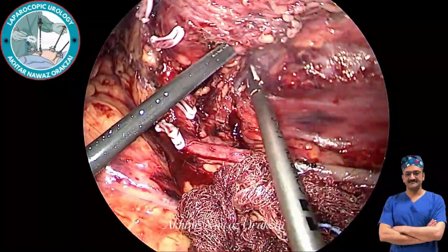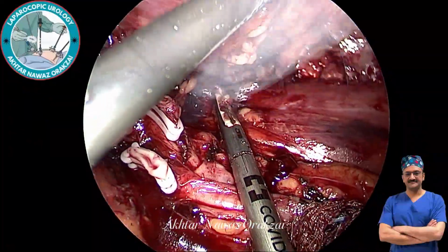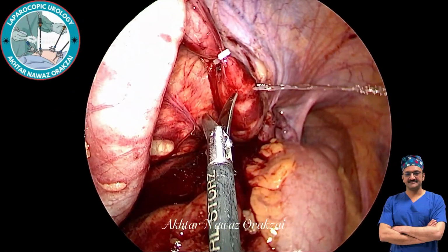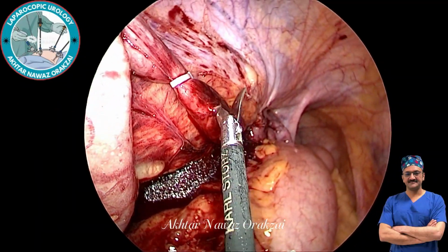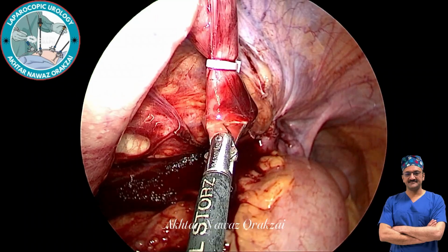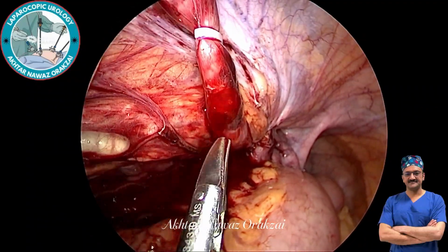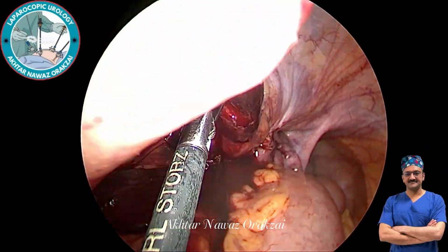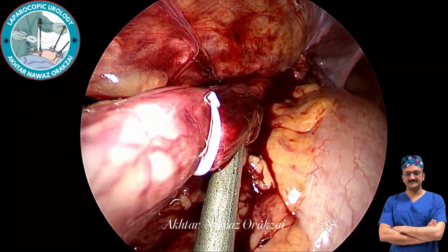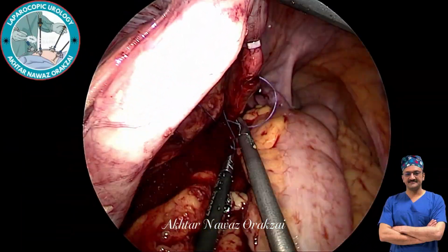Upon dissection of the distal ureter, I tried to locate the exact location of the ureteric obstruction. However, I realized that it was not safe, so I had to clip the ureter, but the diameter was so large that the clip could not be applied completely. So I just opened up the ureter so that the urine in the distal portion of the ureter is aspirated, and then I used suction inside it so that it is empty, and then I suture ligated it.